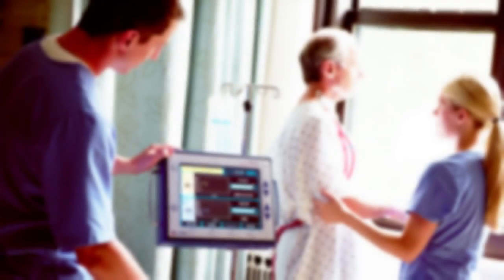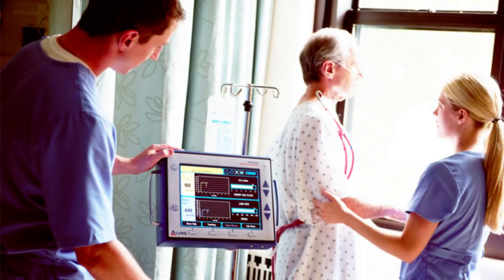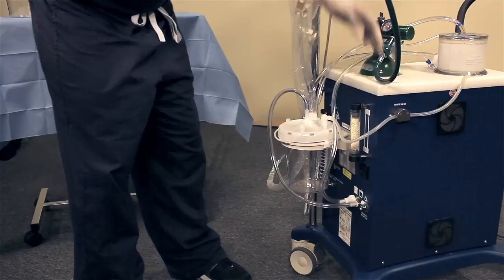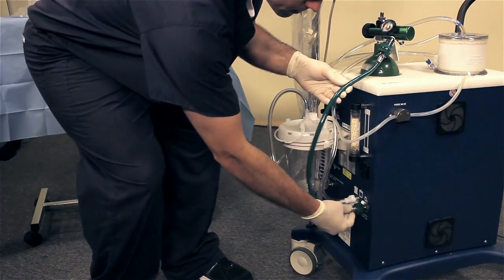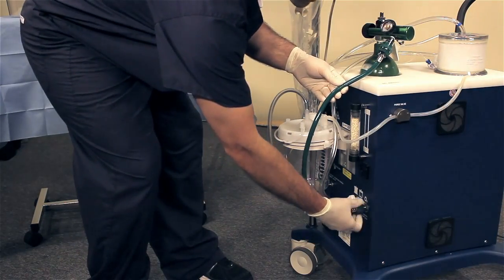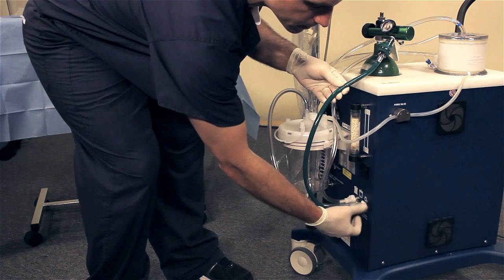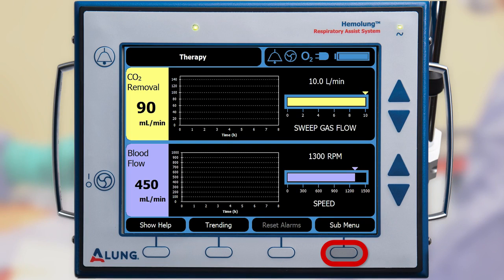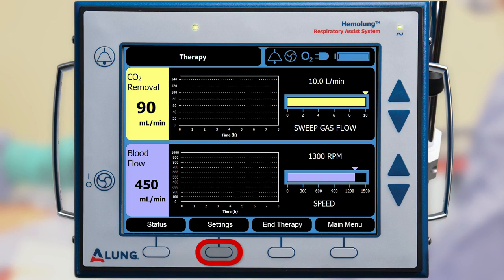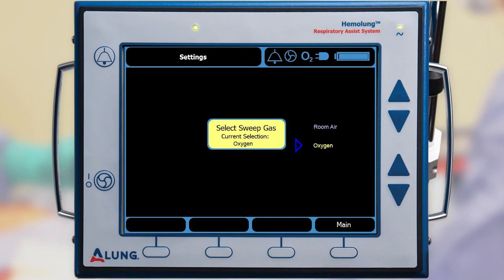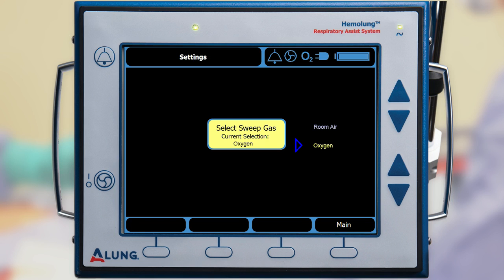Either room air or oxygen may be used for the sweep gas. To use oxygen, first connect the oxygen hose to the Hemolung controller. Press the submenu button followed by the settings button to display the selection screen, then turn on oxygen. Use the arrow keys to select oxygen, then press the main menu button to return to the therapy screen.